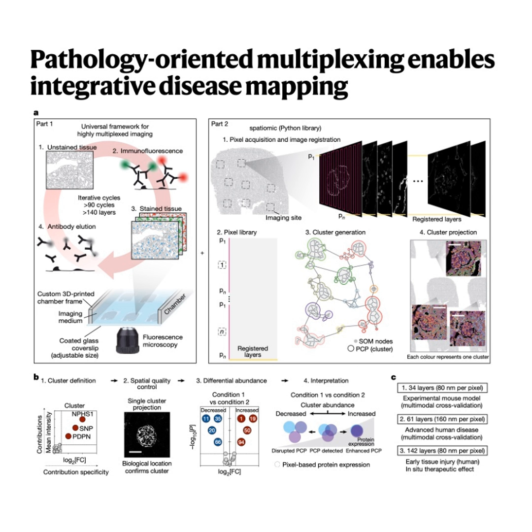Yes, but, and this is important, the treatment did not fully reverse all the T2D-associated changes that PathoPlex detected. It suggests that even with current best therapies, some level of cellular stress might persist. Which implies there's room for improvement, maybe needing combination therapies or different targets to fully halt the progression, even at these very early stages. Precisely. It highlights how PathoPlex can offer a much more sensitive measure of both early disease states and the true, deep efficacy of interventions, potentially guiding development of better treatment strategies. It really unlocks features of injury that are just invisible to classical methods.